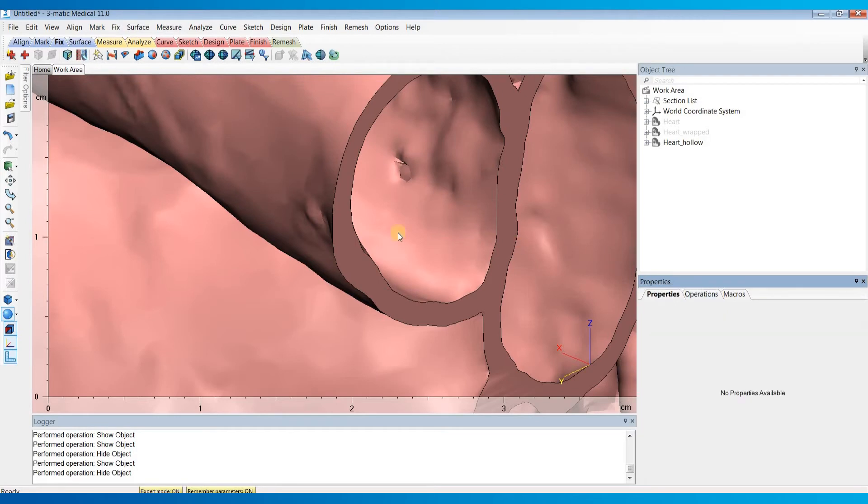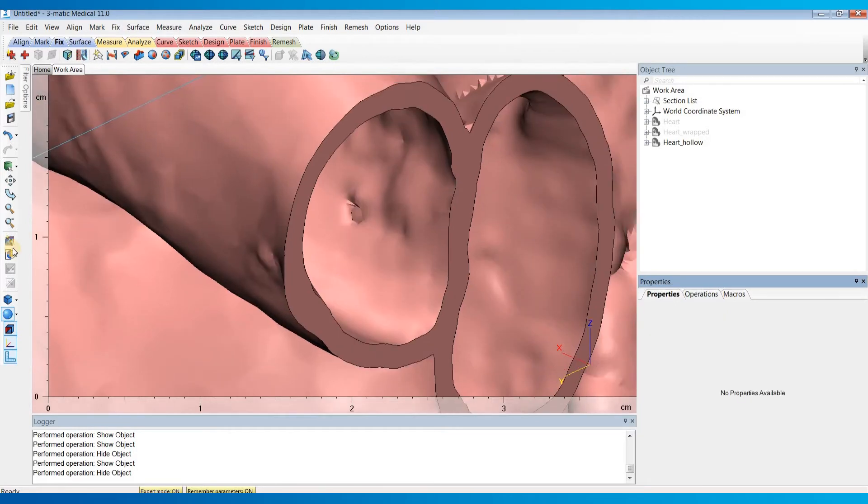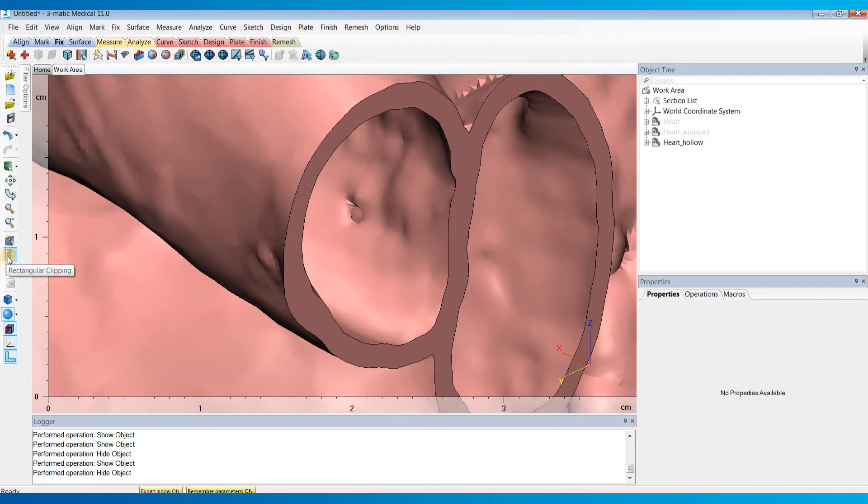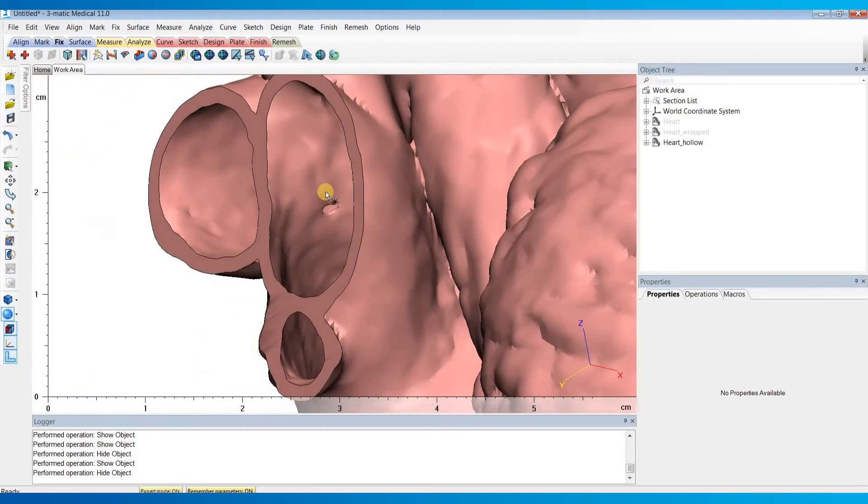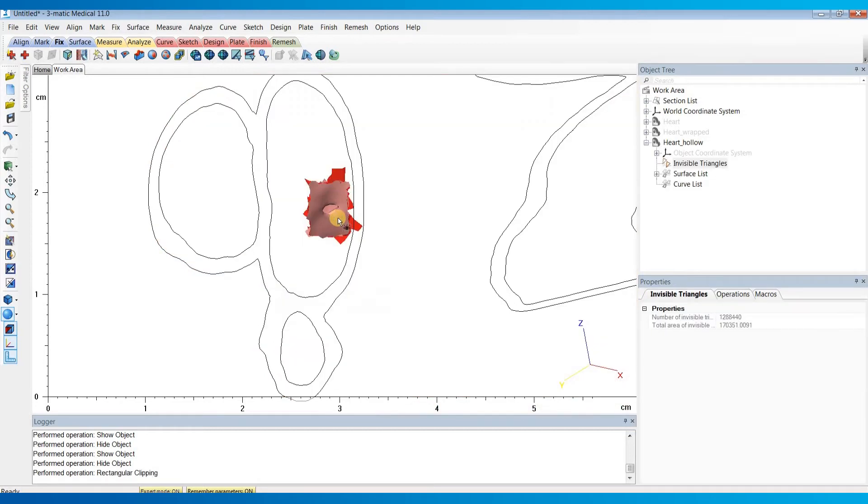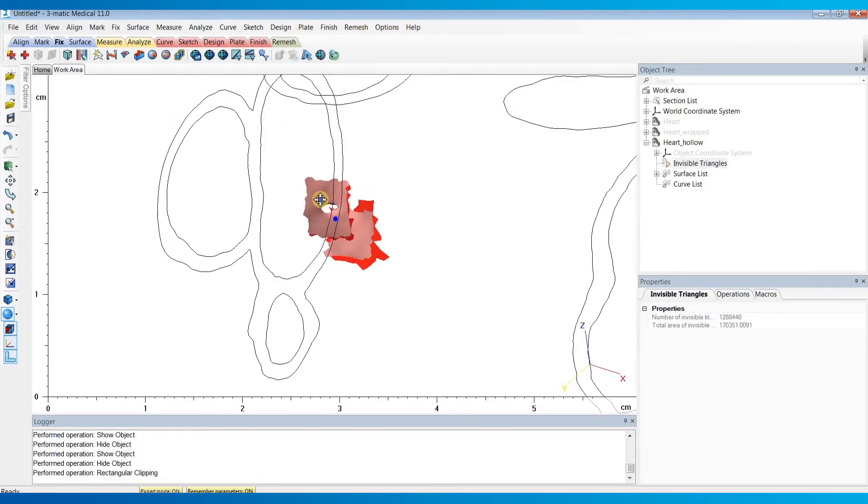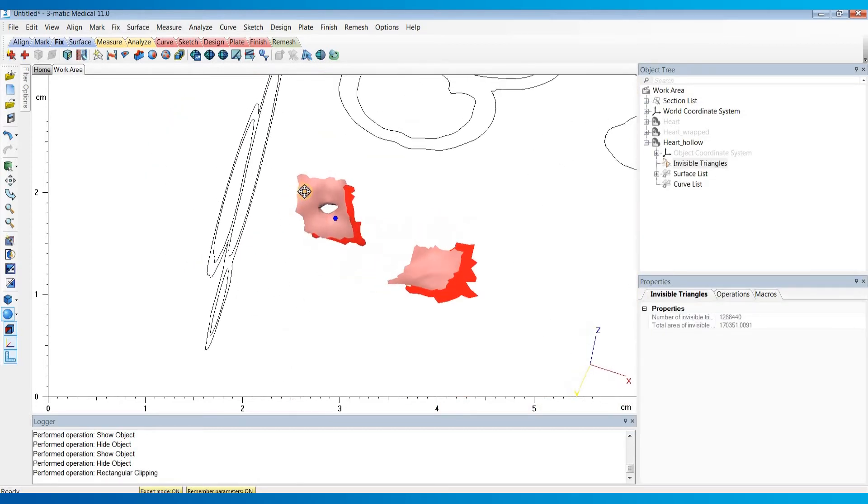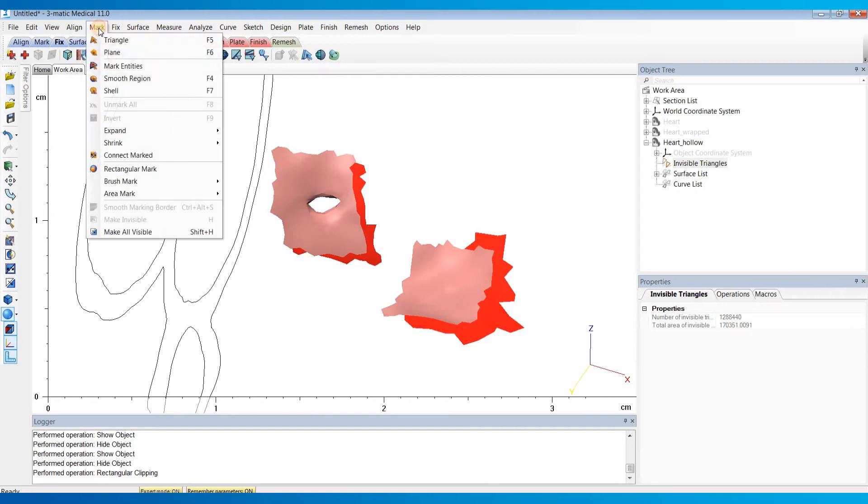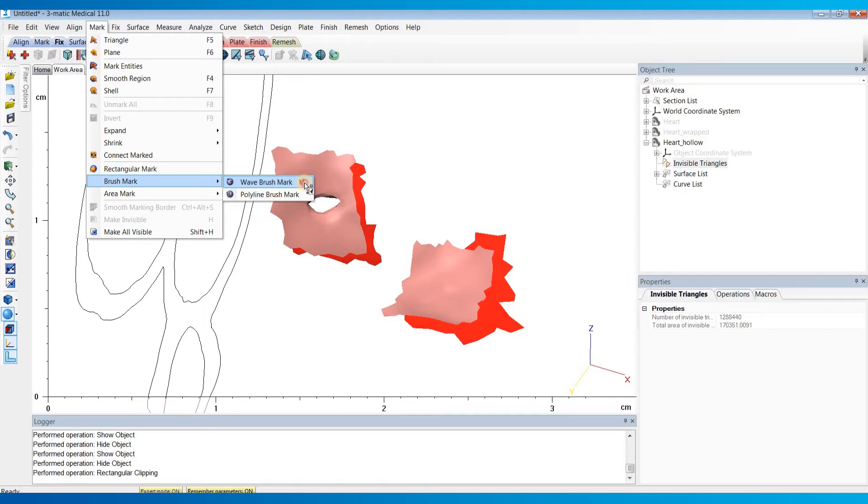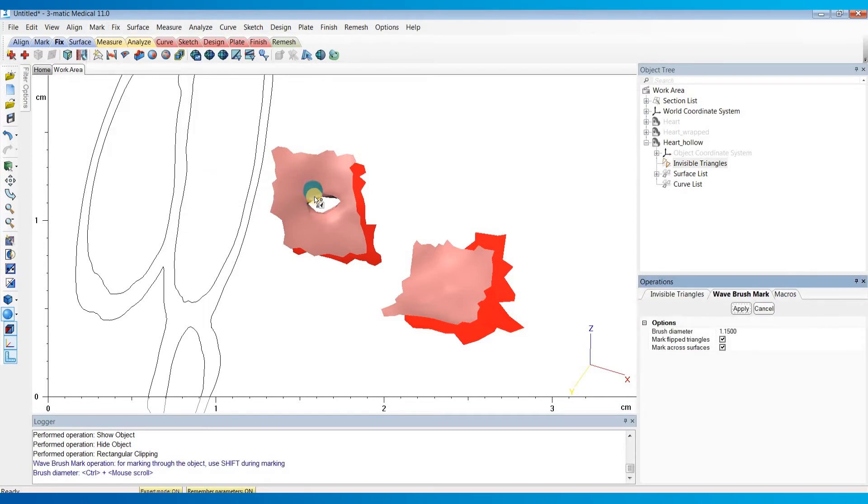The first thing I'd like to do is use this rectangular clipping button to isolate this region of the hole. Once I've drawn a triangle around that hole, I'll go to the mark menu and do brush mark, wave brush mark. You can also hit M as a hotkey. Now I'm just going to mark the region surrounding those holes.